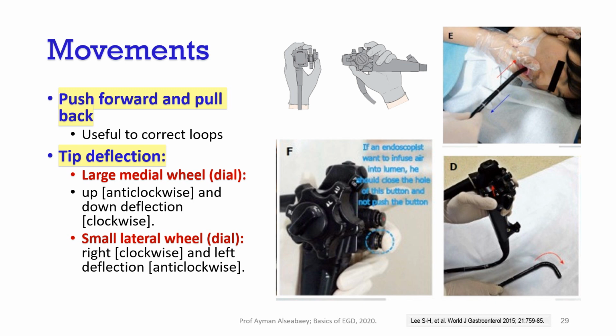In a patient with gastric outlet obstruction or a J-shaped stomach, or a patient with obesity, sometimes the endoscope forms a labile loop in the stomach and it prevents you from negotiating the duodenal orifice. So in such a condition, I have to rotate the endoscope clockwise and pull it back to the cardia, aspirate all the air in the stomach, and try to push forward again.